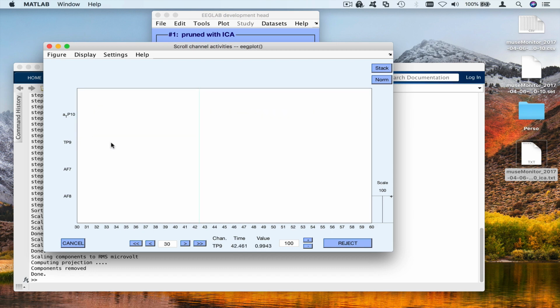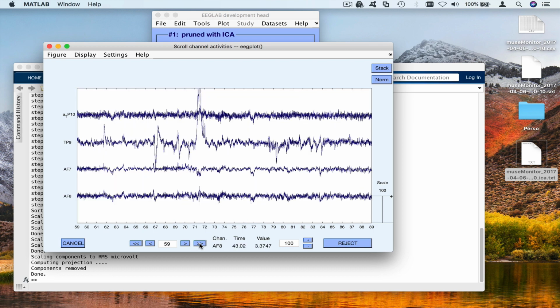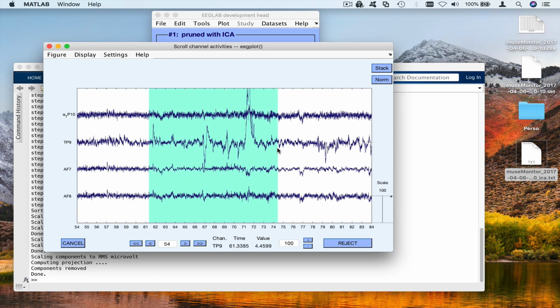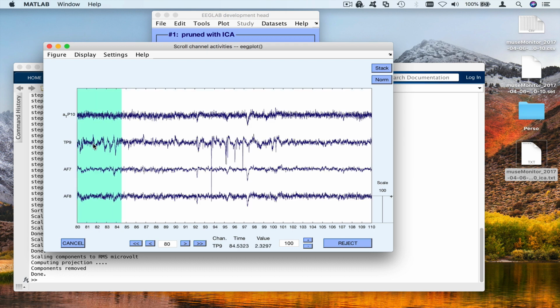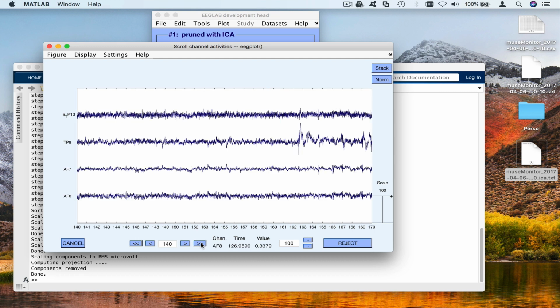Here we're going to remove this section as well. And here we have an artifact. Here we have something, but I'm going to keep this. It's not too bad. We can't remove everything. Here, this section, relatively noisy. Here's some noise as well. This might be physiological data because we see the high frequency. It's unclear. This is not because it's slower.